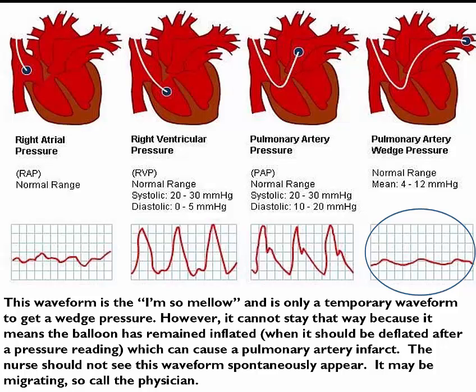However, it cannot stay that way because it means the balloon has remained inflated when it should be deflated after a pressure reading, which now can cause a pulmonary artery infarct. The nurse should not see this waveform spontaneously appear. It may be migrating, so call the physician.